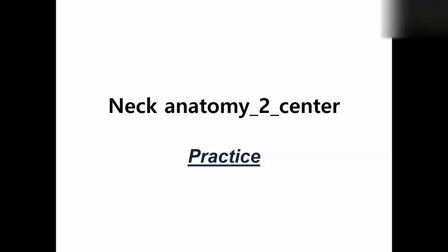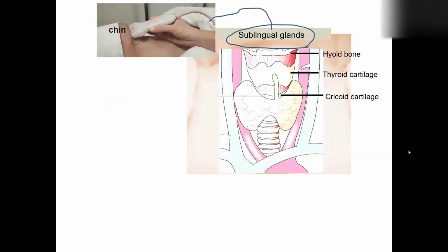Hello. Today, I organized the contents to supplement the last video. In the last video, I talked about starting ultrasound with the sublingual gland when doing neck US, but it may not be easy to find a sublingual gland by ultrasound. So, I'll show you the actual location of the probe to find it by ultrasound.